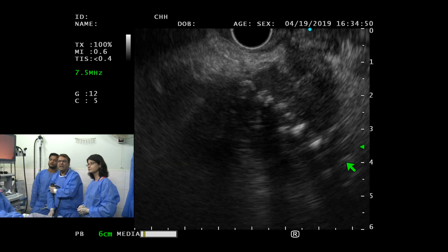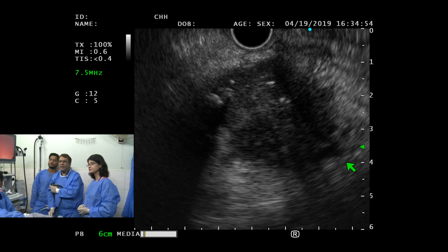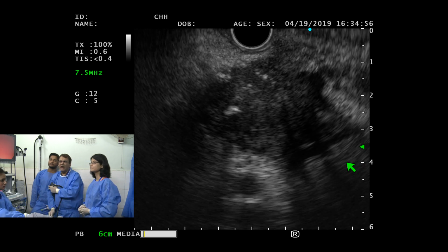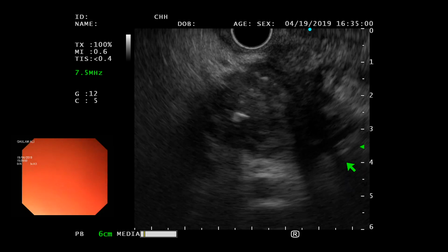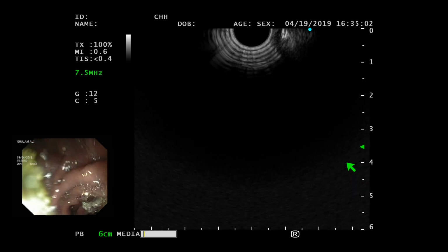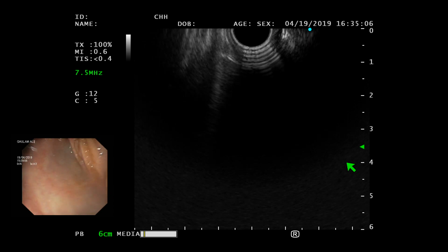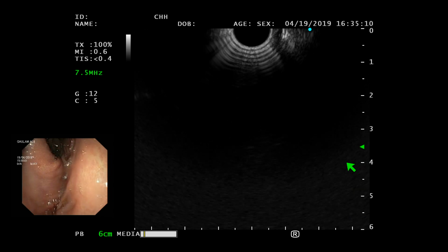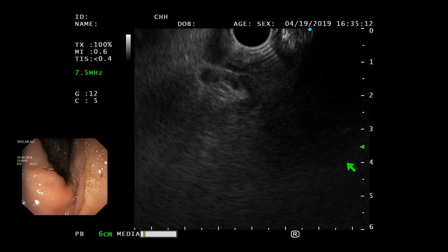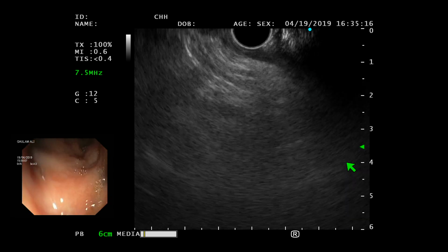I think this is, and I fell back now. So I'm back into the stomach or at the pylorus. I'm sitting right there. You remember, this is what I did a FNA of. Okay, so here, yeah, I'm back into the stomach. This is all chronic pancreatitis, extensive chronic pancreatitis with acute changes. Okay. So one more thing.